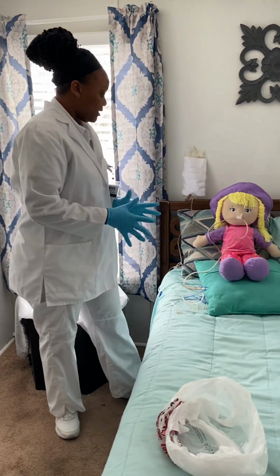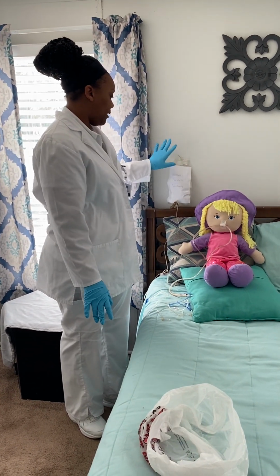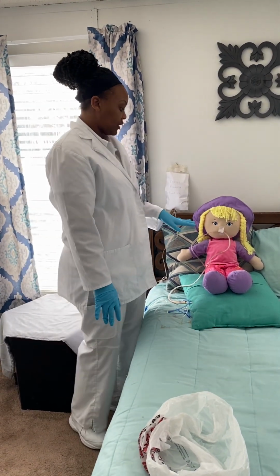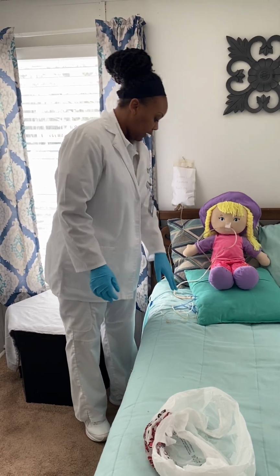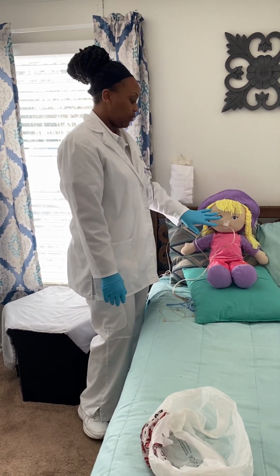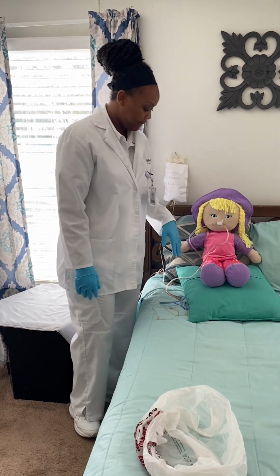So after all that's been done, I want to make sure that my feeding bag and my administration set would be changed every 24 hours. You want to check gastric residuals every 4 to 6 hours. And if you were giving it on the abdominal site, you want to assess and clean that daily. But we gave it in an NG tube site, so I would just assess and clean that daily.